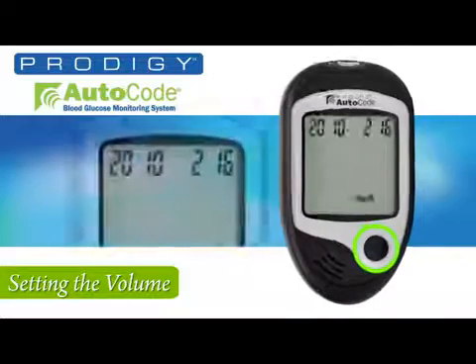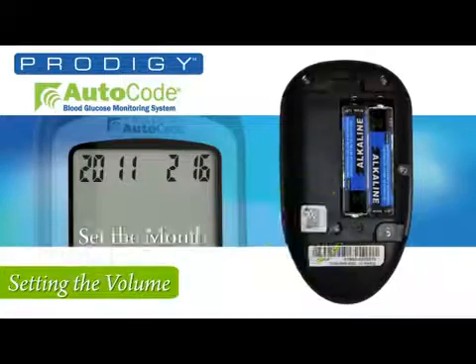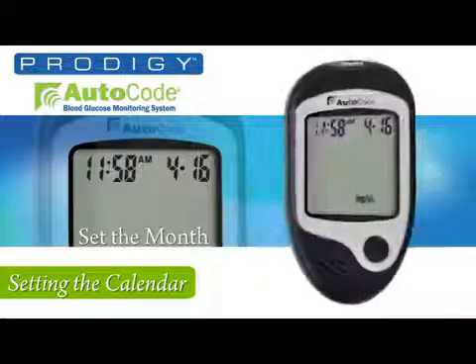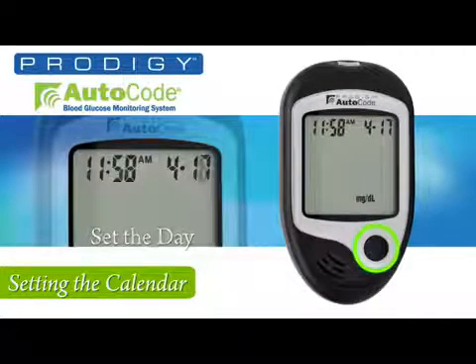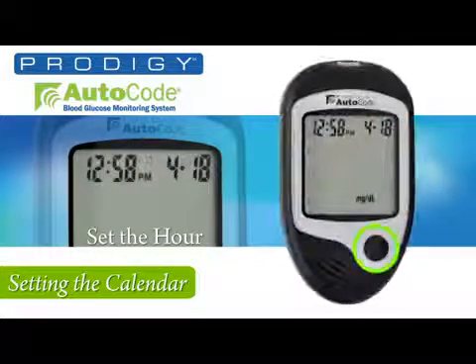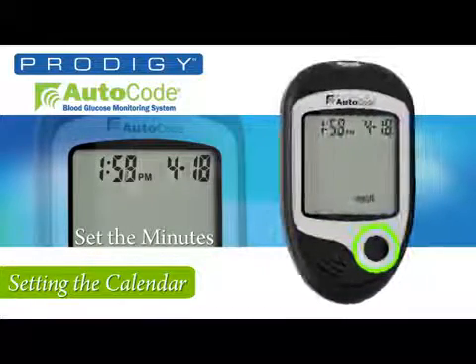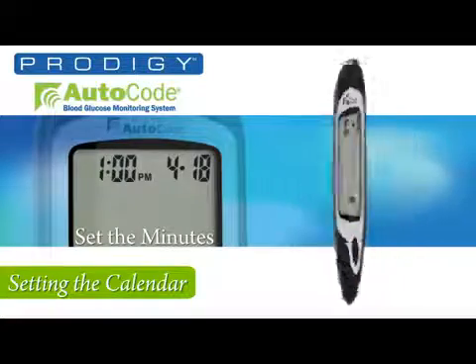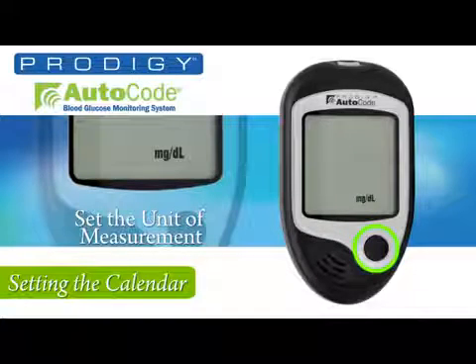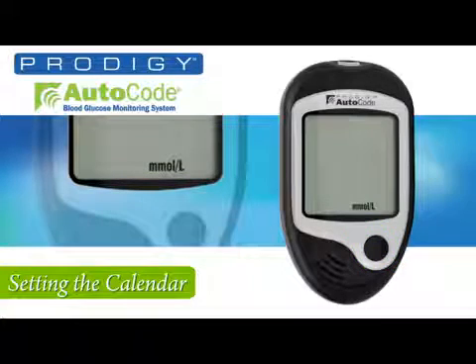Press the set button and then the M button to advance the year. Pressing the set button now allows you to set the desired month using the M button. Set your month and press the set button, returning to the front to set the desired date. Press the set button to set the hour, then press the M button for the desired hour. Press the set button to set the minutes, then press the M button for the desired minutes. Press the set button to set the unit of measurement, and press the M button to choose milligrams per deciliter for American or millimoles per liter for Canadian.